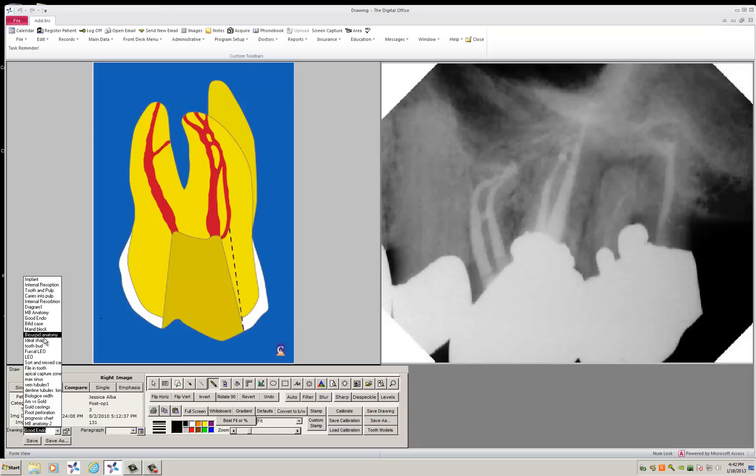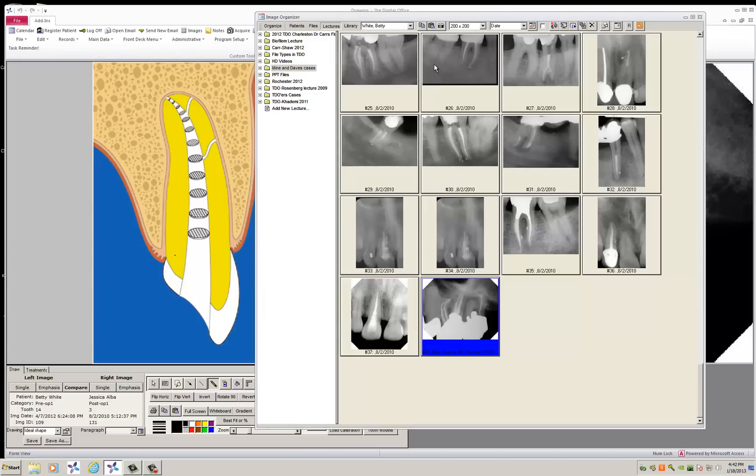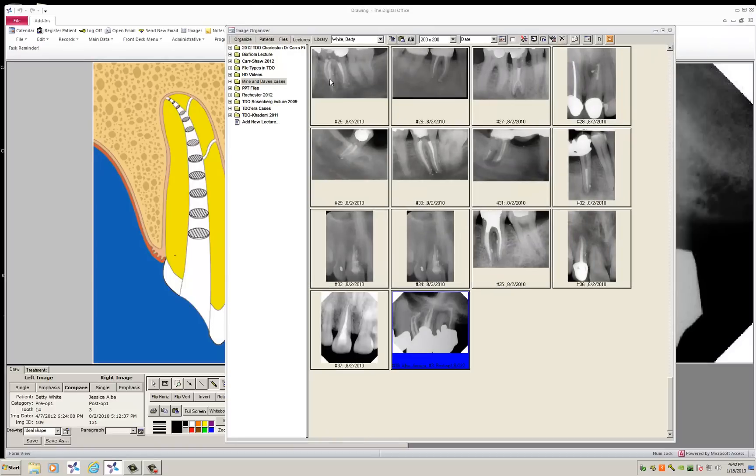For example, you can see there's nothing in here about fractures. Let's say I wanted to add, we all have to talk to patients about fractures. What I would do is double click. It brings up the image organizer.